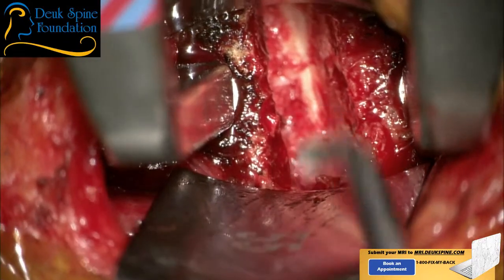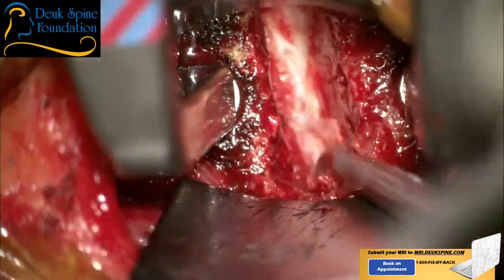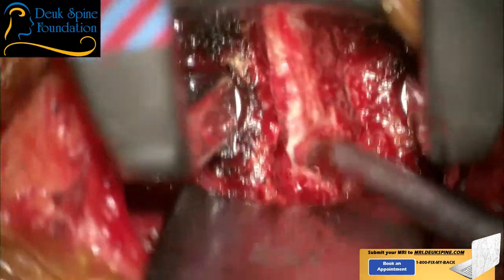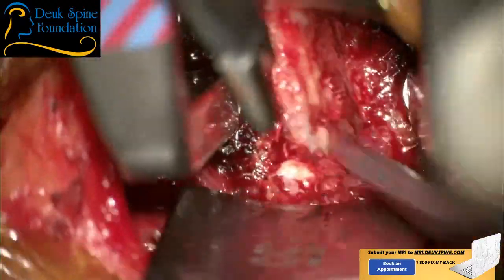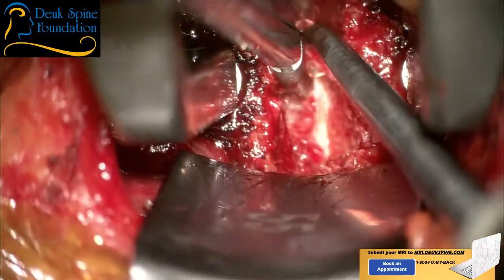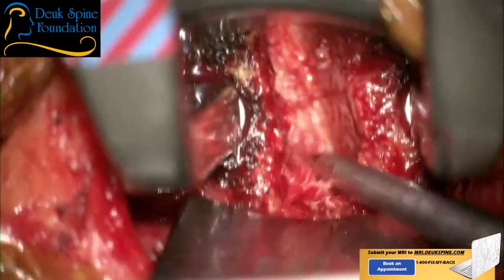I can see the herniation right here, right there. You can see things moving out. That's where the worst part of the herniation is. And we're going to get down to all that. I just got to scrape it all out. Like I said, we've taken out 90% of the disc to get to the part in the back where the spinal cord and nerves are being pinched.